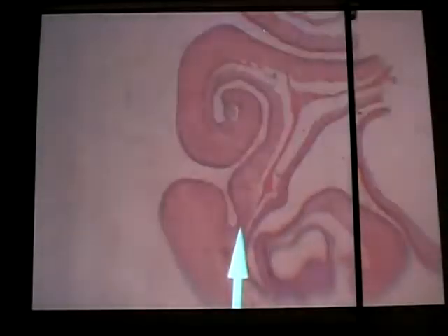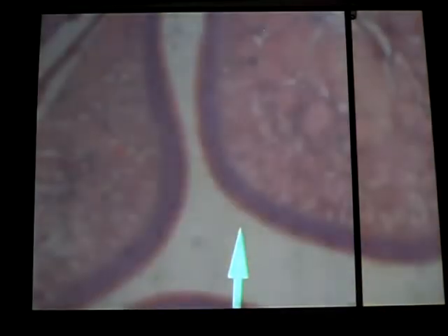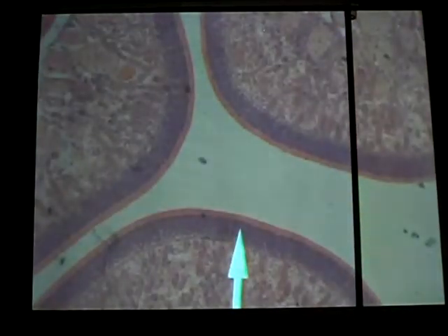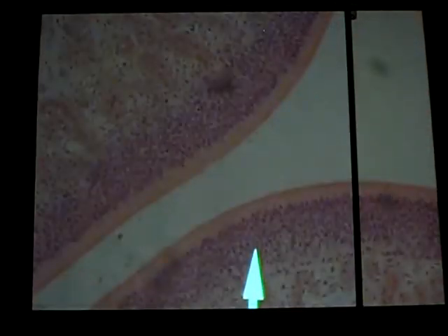Alright, the olfactory mucosa. Like I said, once you see it, you recognize the difference. So this is our scanning view. Notice even at low power, look at the difference in the thickness here. So that's your epithelium here. That's your pseudostratified epithelium. Compare the thickness to what we were looking at before.